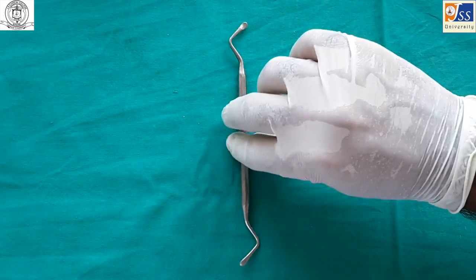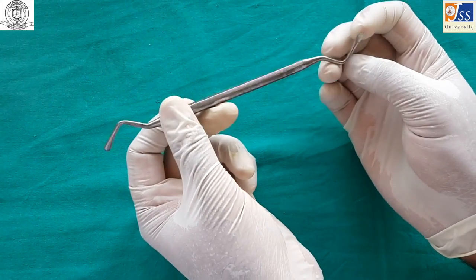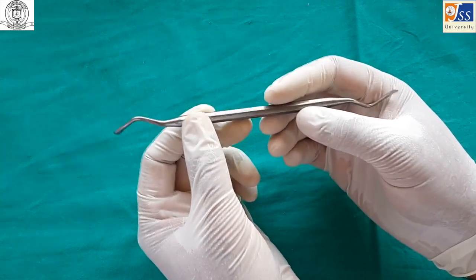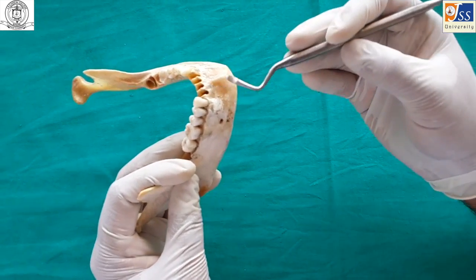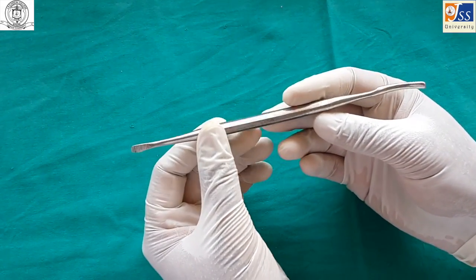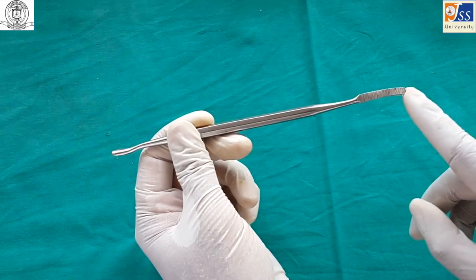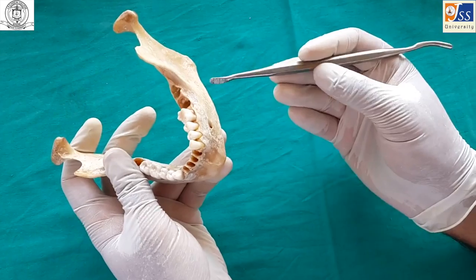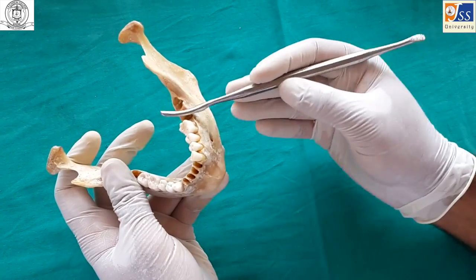The curette is a double-sided instrument used for removing any periapical pathologies like cysts or granulomas. The bone file is also a double-sided instrument — one side has a flat end and the other has a curved surface, with surface serrations pointing backwards. It is used to smooth any sharp bony projections after extraction and during alveoloplasty procedures.